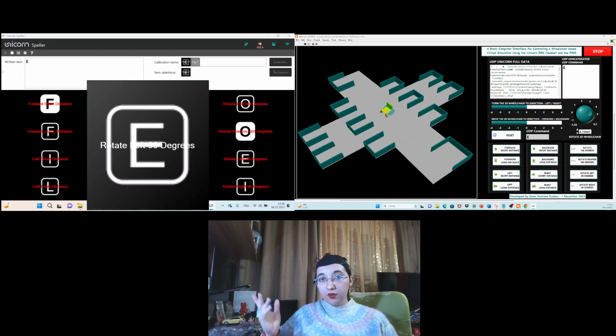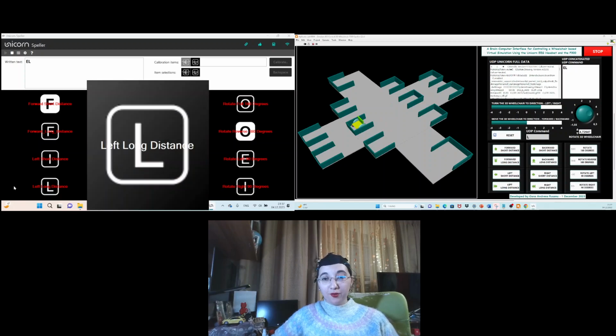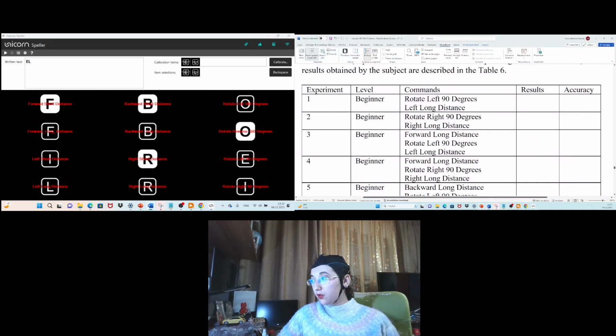Perfect. We can see the movement of the 3D wheelchair. Perfect. So we can see that the 3D wheelchair reached the first position. So here we can add the results, pass and pass, and accuracy is 100%. Next.